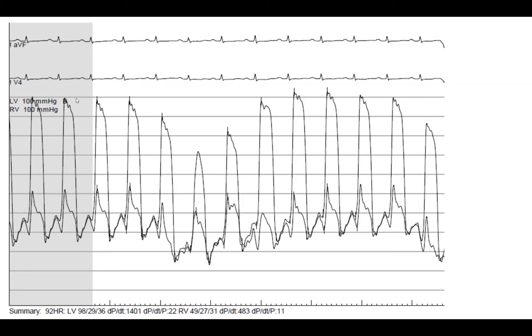The catch, though, is that you should not analyze the peak pressures. The systolic pressure of the right ventricle seems to be rising while the systolic peak of the left ventricle also seems to be rising — so at initial look, they appear concordant. But the way you analyze concordance versus discordance is to not look at the peak pressure. You have to look at area under the curve — the pulse volume of each ventricle. That's what correlates to stroke volume.